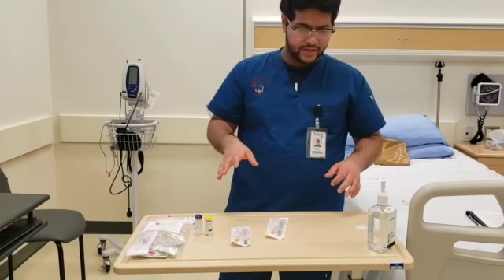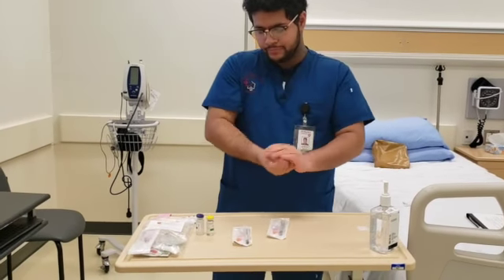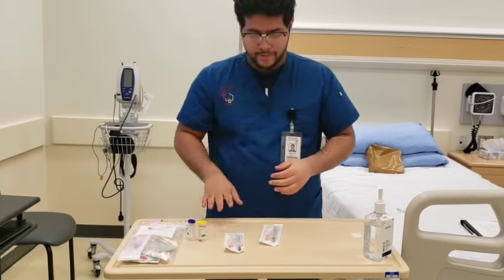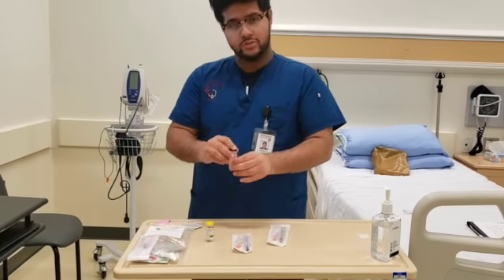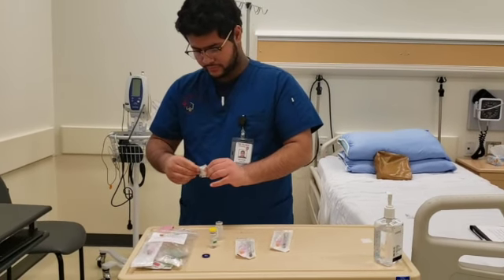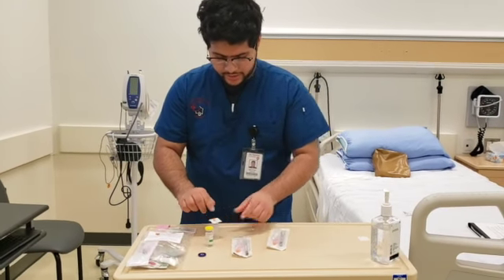The vials that we need. Now we'll be preparing the medication. First, do some hand hygiene, and now what's going to happen is I will pop off the safety caps, put the alcohol swabs on it to keep it sterile, and then put the appropriate amount of medication in the syringes. So first we'll be doing the heparin. We're going to get the alcohol, keeping it sterile, just going to wipe it a bit and then just keep it on.